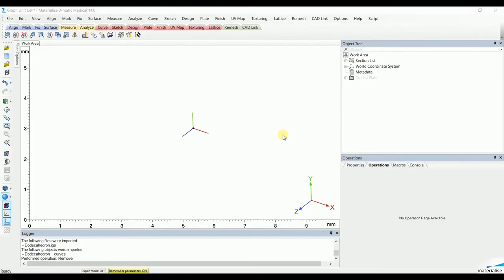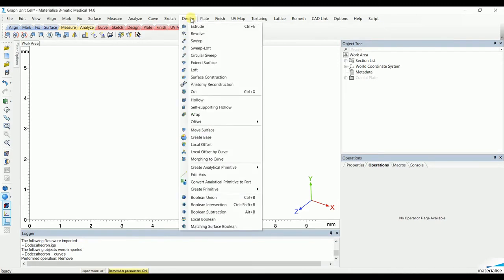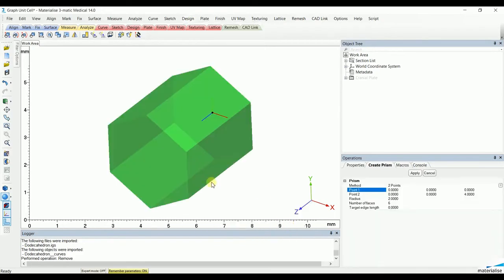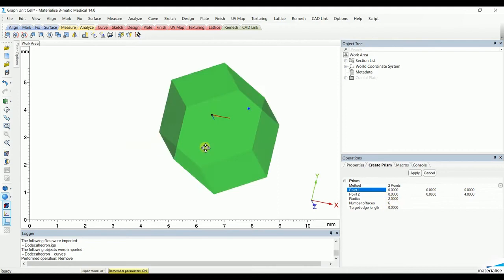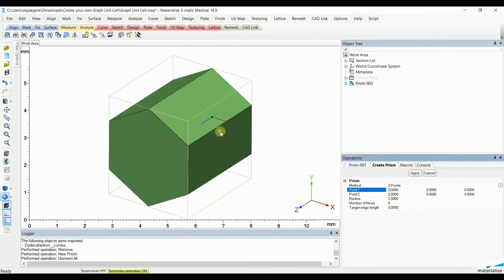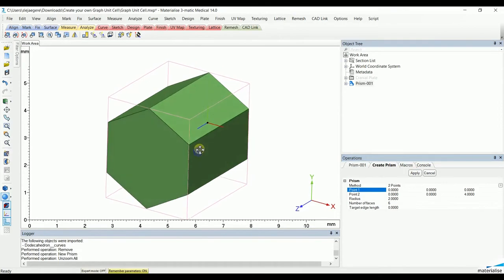To create your own graph unit cell from a base primitive, go to the design menu and select create primitive. In this case, create a prism. These primitives can have different shapes, but in this case we'll go for 4mm long, 2mm radius, and 6 faces creating a hexagon. Hit apply, creating the primitive we're going to base our lattice structure from.